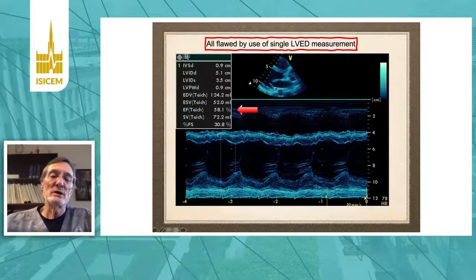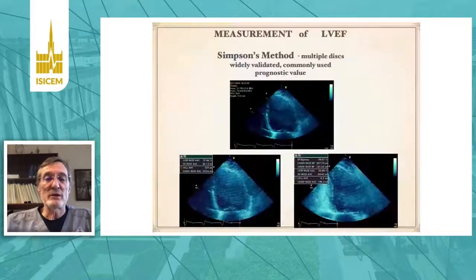What they do is take one line of ultrasound across the base of the heart, as shown up here. We transform it into M mode, and from this, with clever calculations, the algorithm determines what the ejection fraction is. But in all honesty, in the critically ill patient, it is really nonsense. What you have to do is look at the whole of the left ventricle.